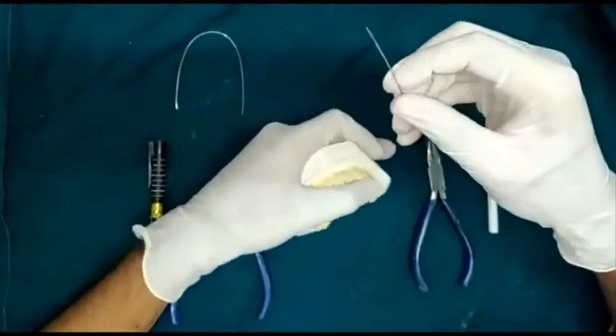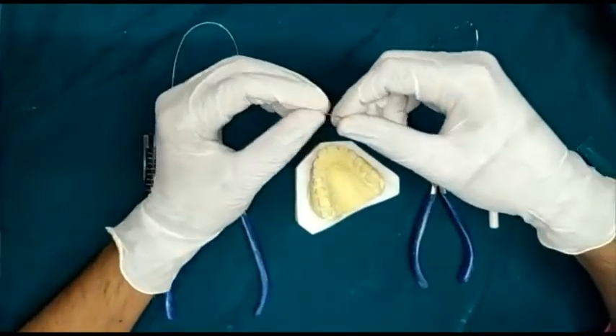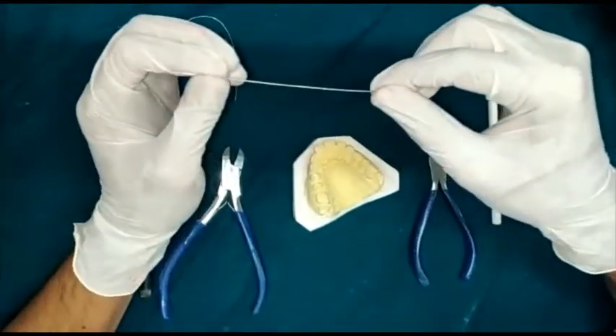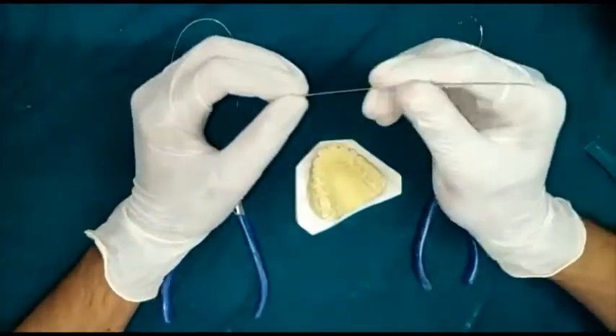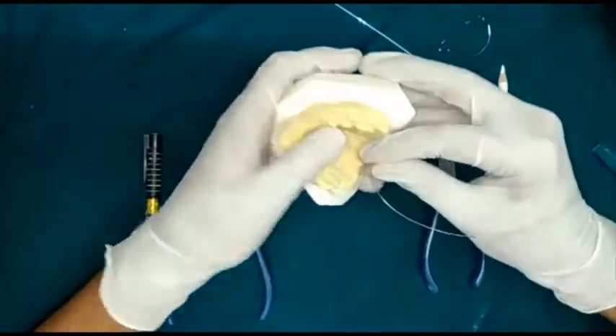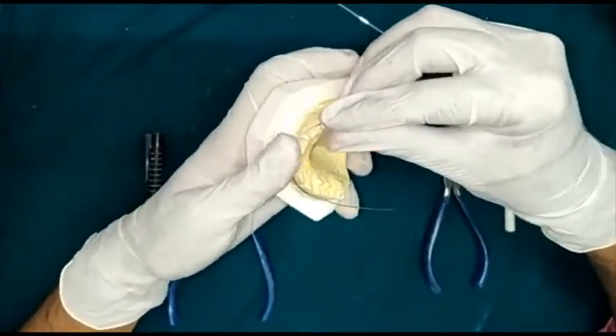Today I will be showing you how to make a long labial bow. We first take a 21 gauge wire, straighten the wire to reduce the stress, and then adapt it to the labial portion of the incisors and the canines.